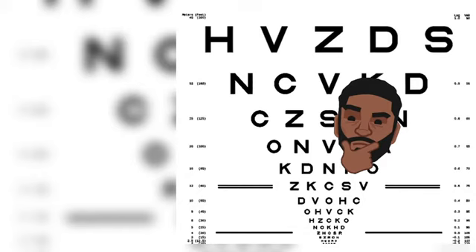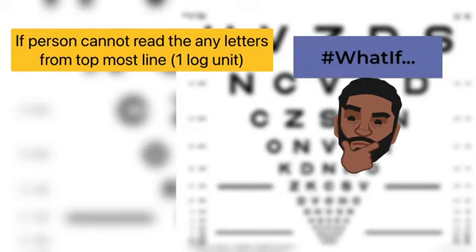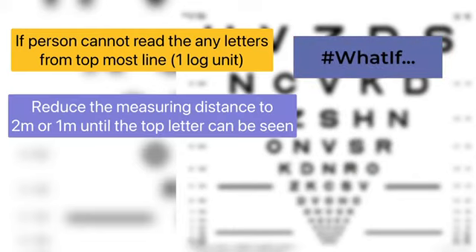Do you know what you need to do if someone is not able to see any letter from the topmost line? In that case, you have to reduce the viewing distance to half. From 4m, you bring down the chart directly to 2m.